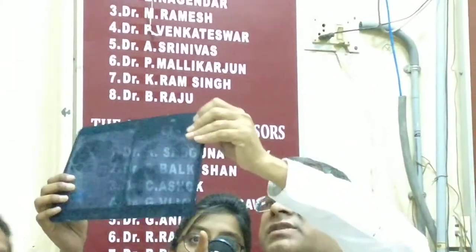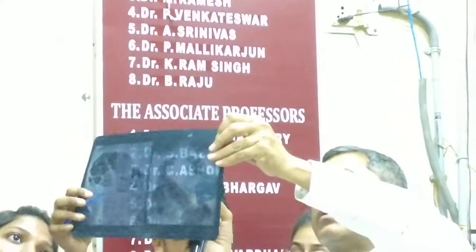Chest X-ray. So it's just in the chest. We have to go like this. Sorry. Cardiac shadow.